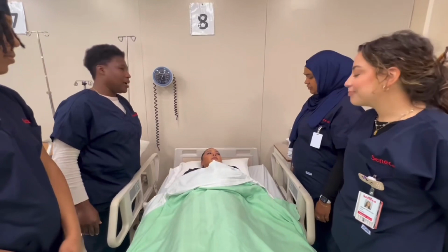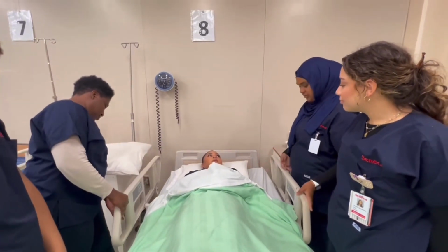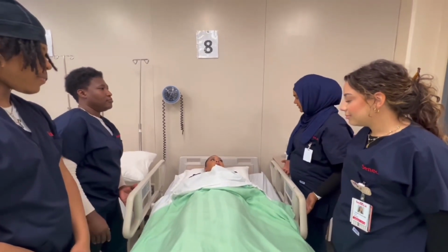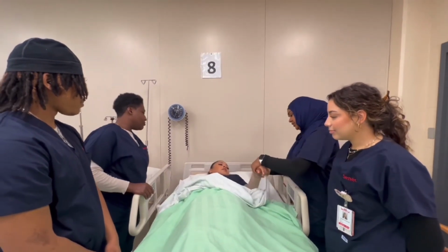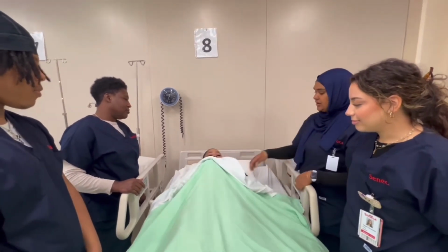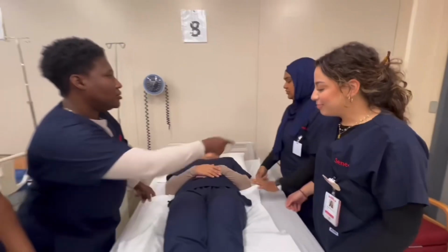The leading nurse is explaining what we're going to do by pulling her closer to the right side to alleviate some of the pain on the left side and putting the bed rails down. And now we are going to confirm the identity of the patient to make sure it matches what we have, the date of birth and full name. And now we're going to put the bed rails down and begin with moving the patient from supine to lateral.